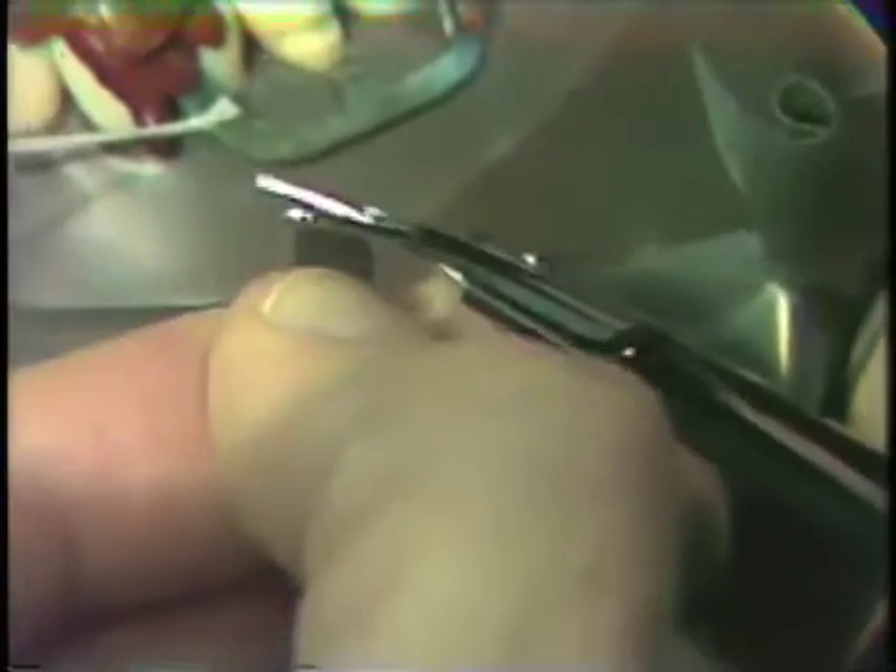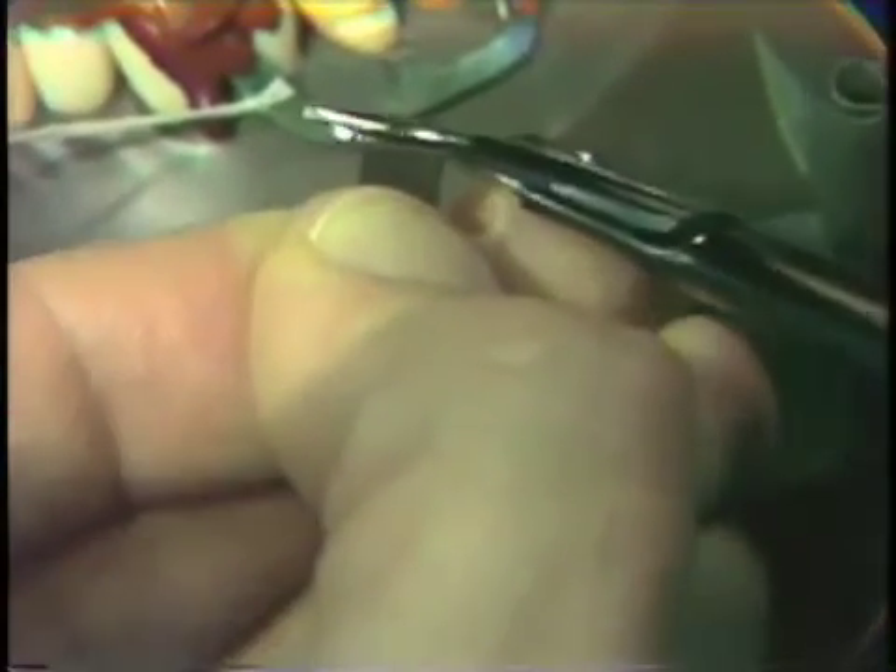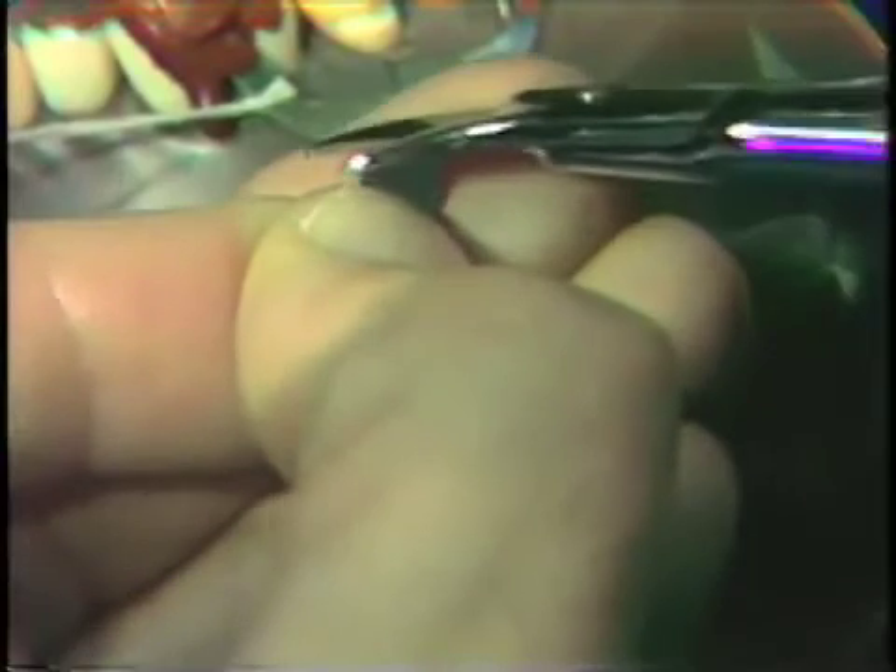This matrix material is very springy and you must hold on to it or it will fly out of your hands as you're trimming. Once again, rounding off the sharp corners.